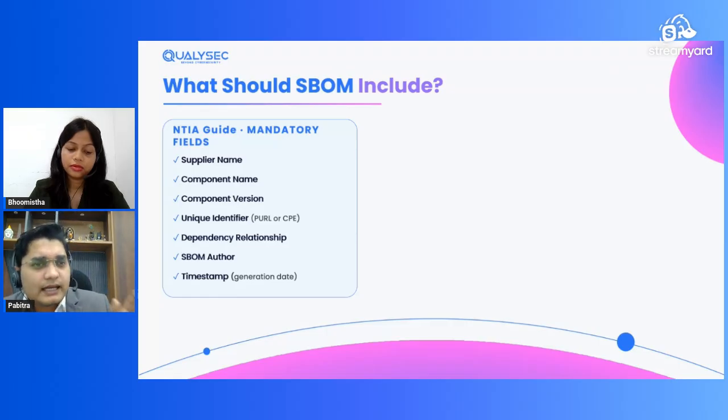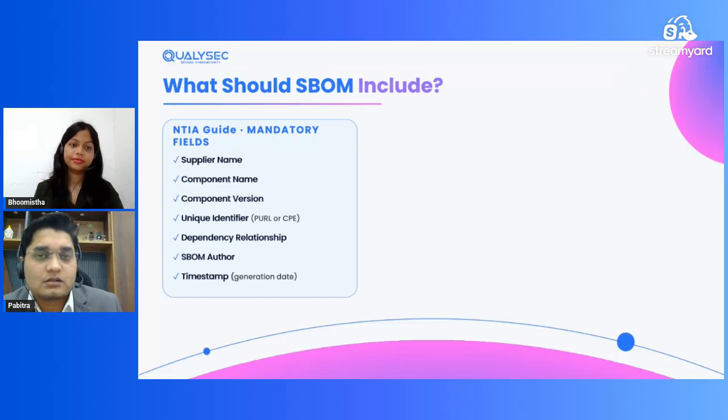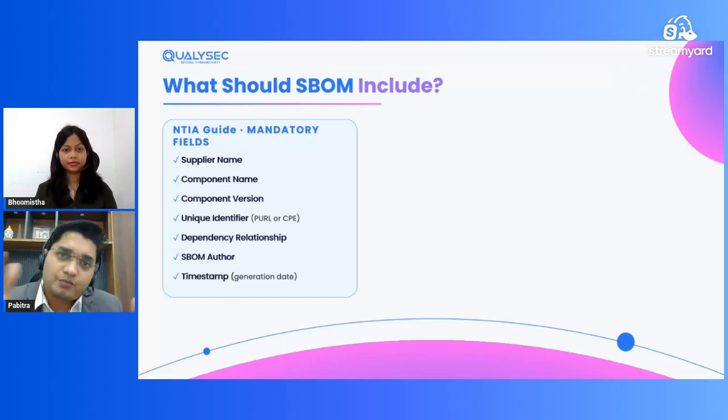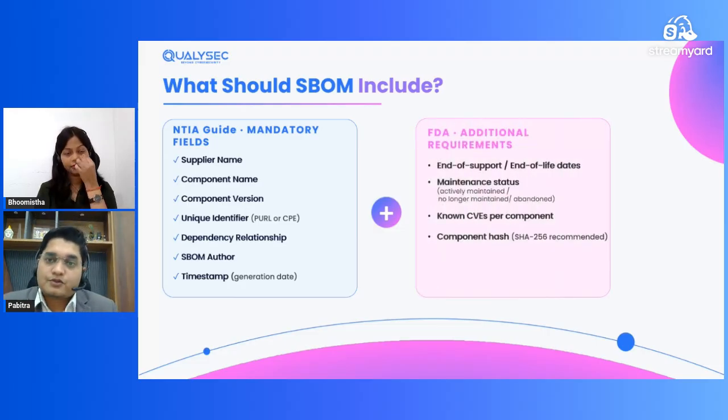But this is the NTIA guide that the FDA wants you to follow. Apart from it, with our experience, and even FDA has released some documentation regarding it, the FDA needs additional information. What is that additional information? They need end of support and end of life data.